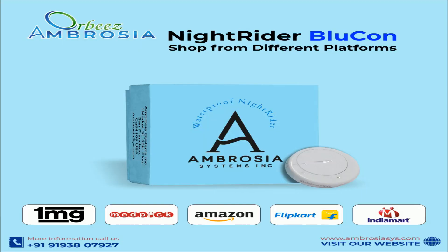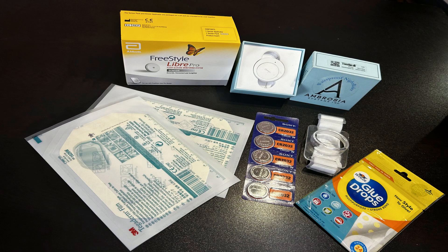You can purchase Blucon Nitrider from all trustable platforms. In the image, we have Blucon Nitrider, Freestyle Libre sensor, Tegaderm patches, glue drops, Sony CR batteries, and a 3D holder.